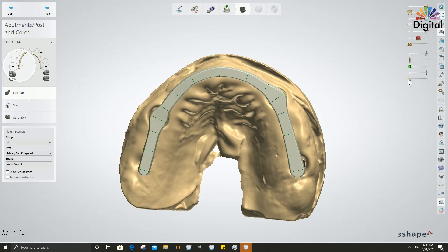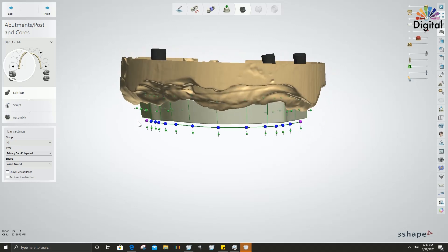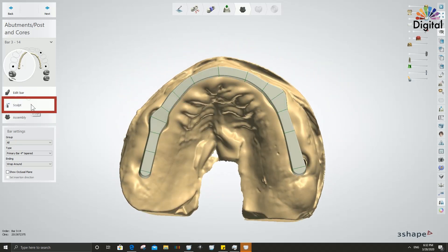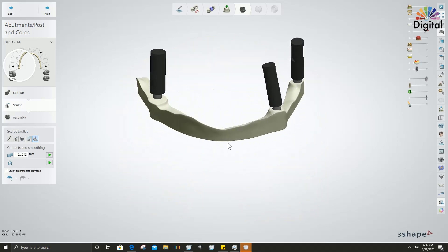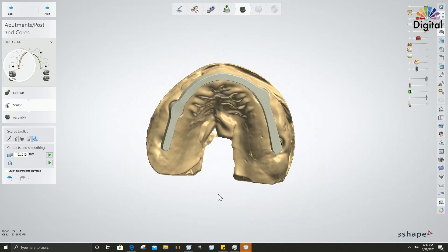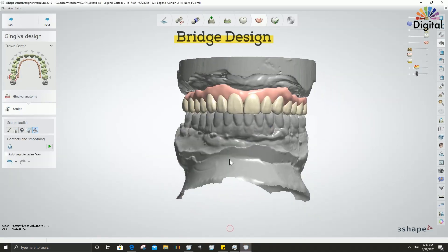We can see where the implant holes are, and I'm trying to make the surface flat and even. In the sculpting, there is a function under the sculpt toolkit which creates the bar bottom shape that can match with the gum tissue — easy, quick, and accurate. Let's check the bridge design here.